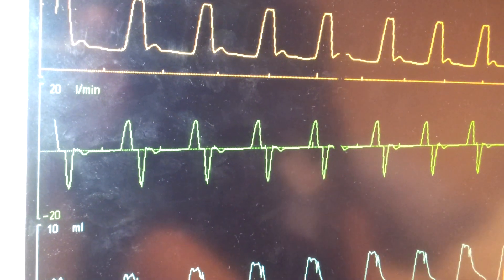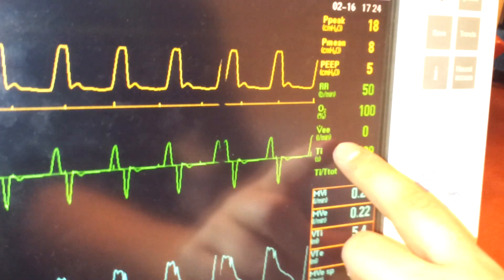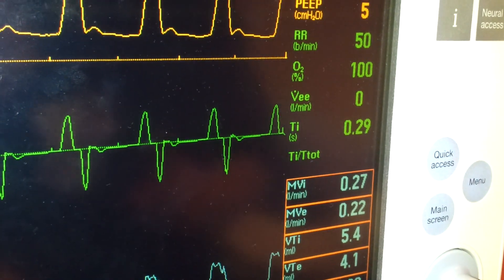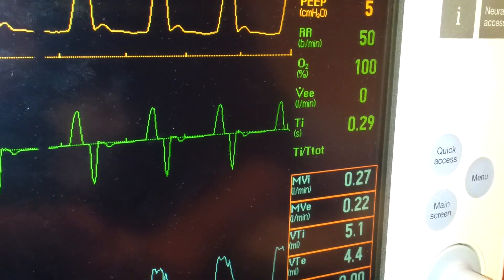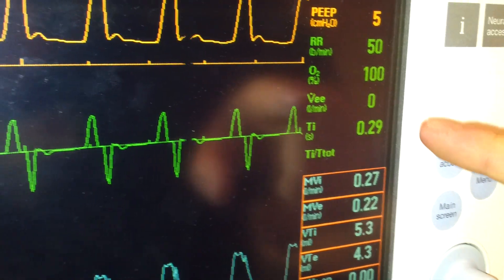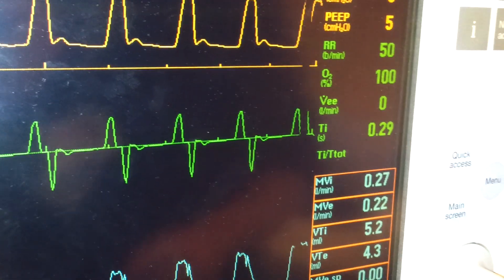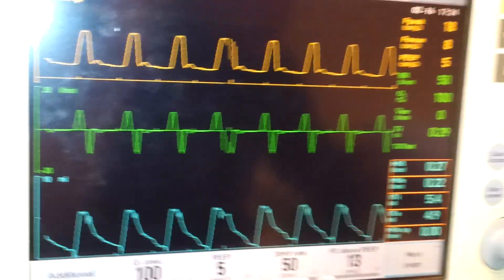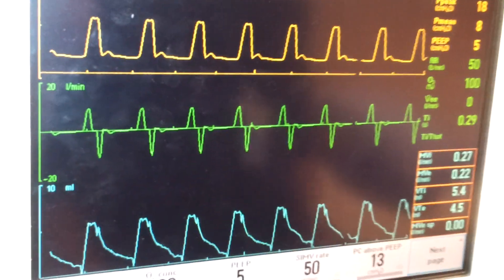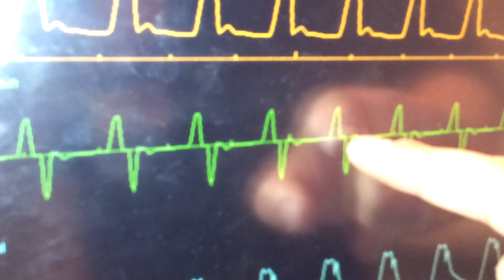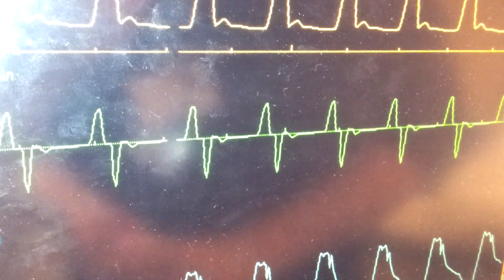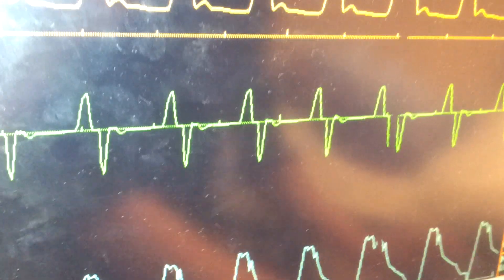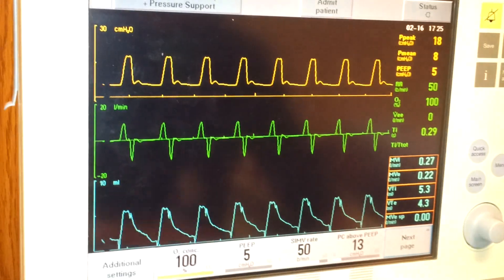You can also go to the next page to check the VEE in liters per minute — that's the flow at the end of a breath right before the next breath is given. Anything above 2 to 3, you should expect a little bit of air trapping. The last assessment is the inspiratory pause — if there's a big pause on inspiration between exhalation, you can check with the doctor about what they want to do. So there are four things you assess on the graphics.